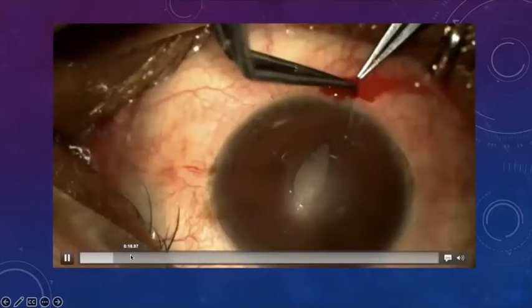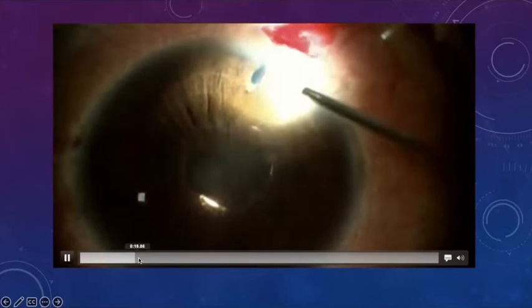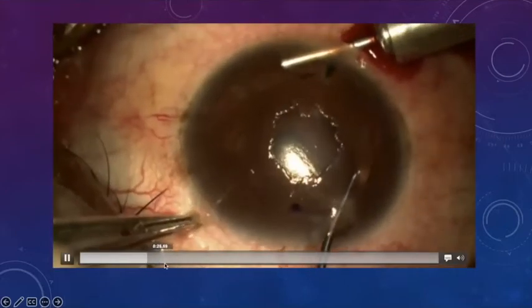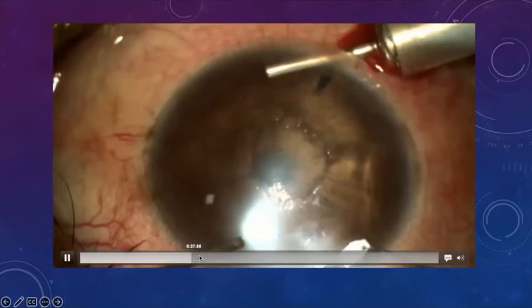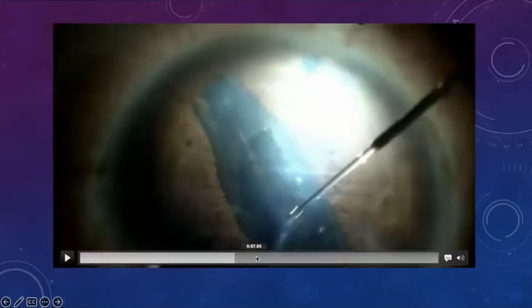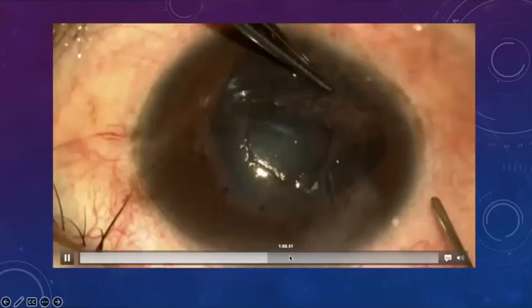Here's a patient where I do phakic PDEK to show you that all of these are possible. This was a young girl, so I did not want to remove her cataract, her phakic lens, her crystalline lens, which was clear. I've done a PI, and then I've got fluid going in this case, and I've marked the size of my descemetorrhexis, and I removed the Descemet's membrane. Once that's done, we load the graft and open the graft up.